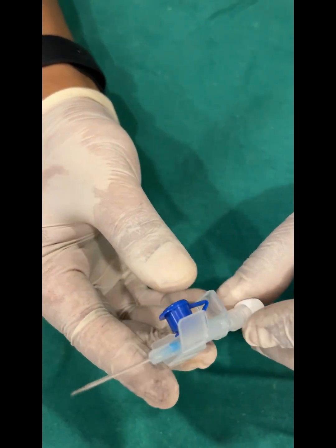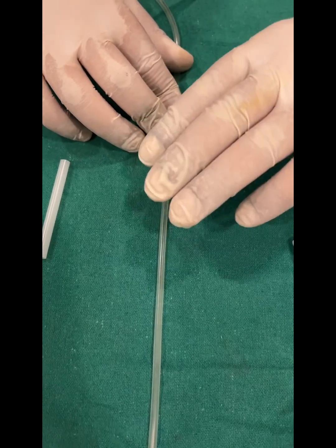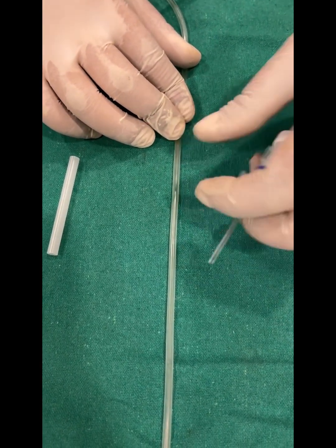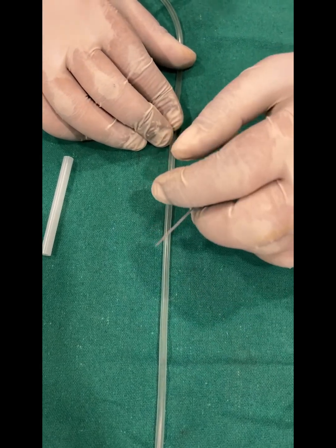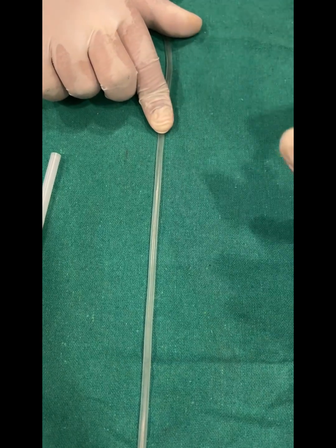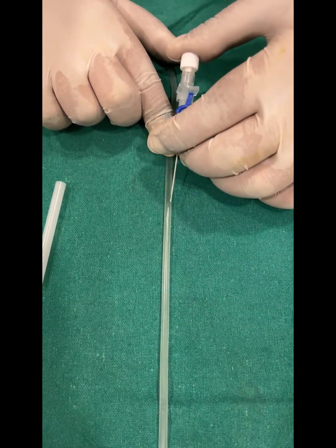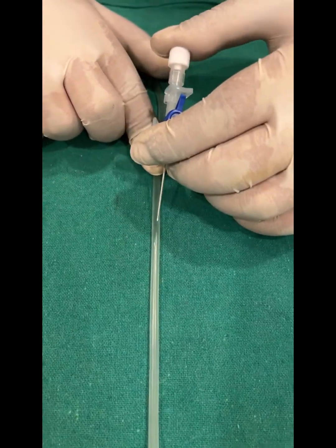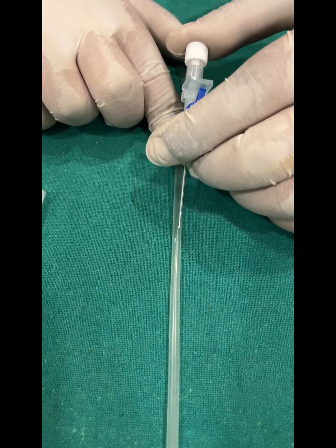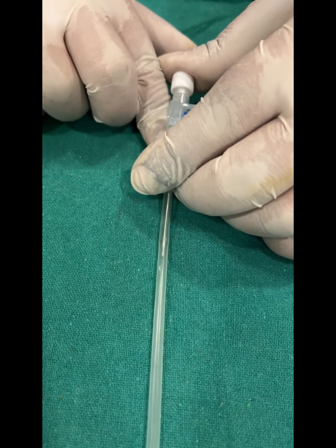Now we will start with our demonstration. This is essentially an infusion set — consider it as a vein. Using our non-dominant hand, we anchor this vein. Once the vein is anchored, we start advancing the cannula. We begin at a higher angle of 25 degrees, and once inserted we gradually reduce the angle and push it in.